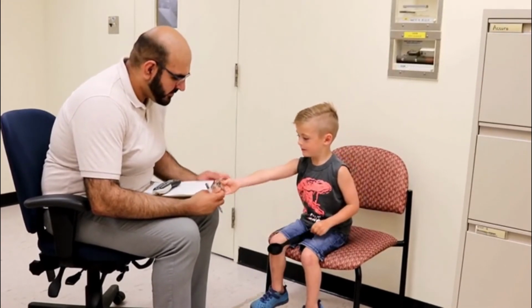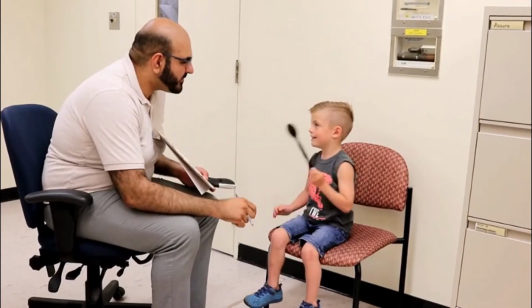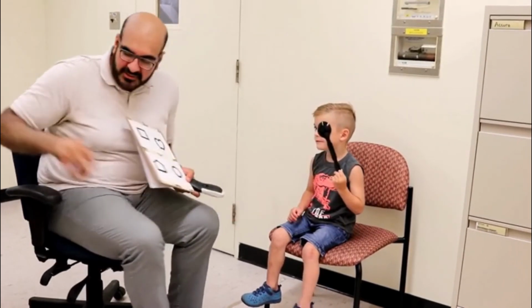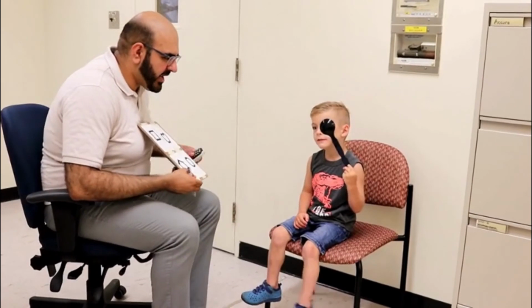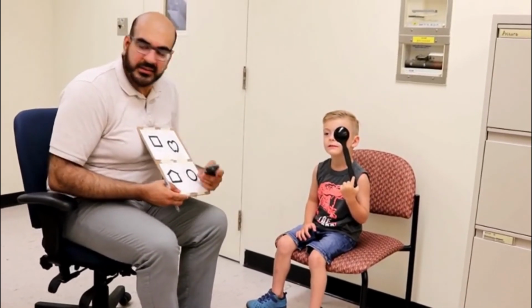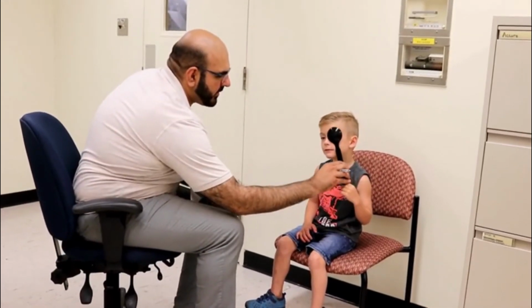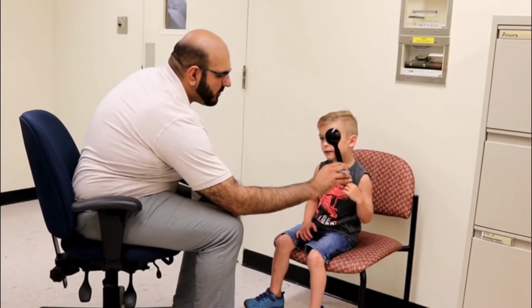I want to see. Can you cover up one of your eyes with the spoon? Yes. Yeah, that one. Excellent. Okay, so look at the screen. And because you were so good at it, we're going to make it a little bit harder, okay? Okay. And do you see the top ones there? Yes. I'm going to help you with the spoon, and we're going to make sure that eye gets covered. Perfect. What's that top shape there?